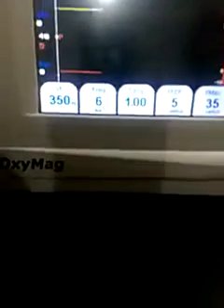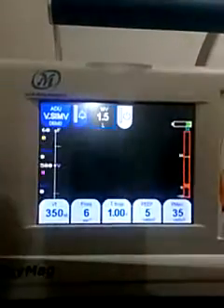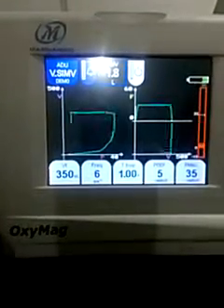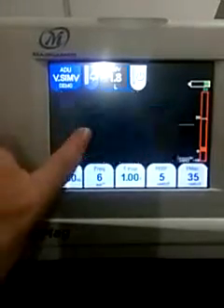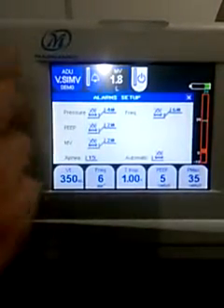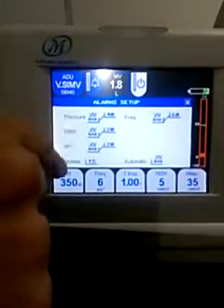For the waveforms, we have three kinds here: flow with time, pressure with time, and volume with time as well. And two loops: volume with pressure, and flow with pressure. Then the alarm setting, with high limit and low limit for all important parameters like pressure, PEEP, minute volume, apnea time, and frequency.